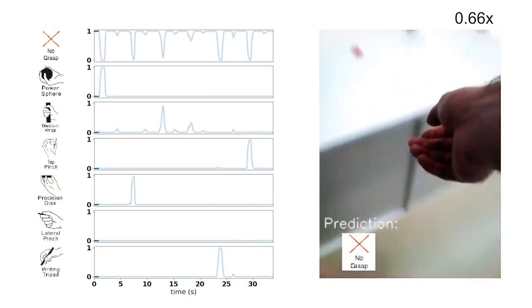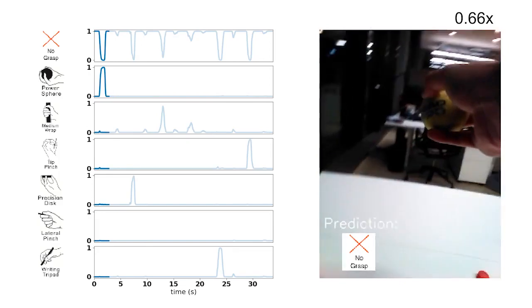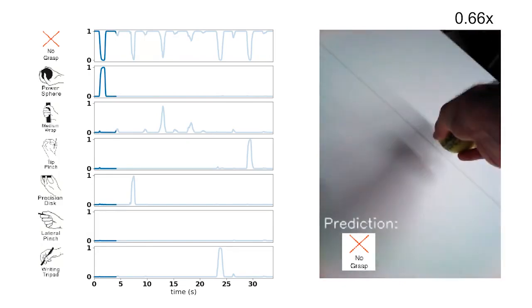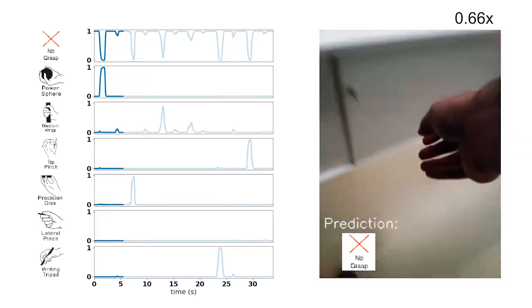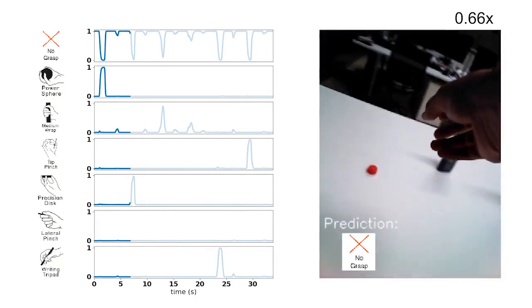We begin with a tennis ball, which correctly produces a power sphere grasp. This is followed by a bottle cap, which correctly produces a precision disc grasp.